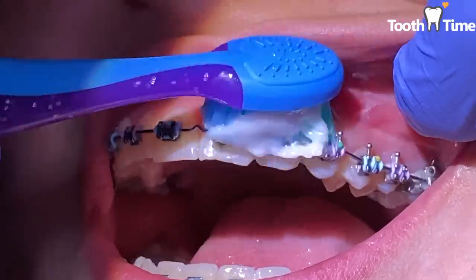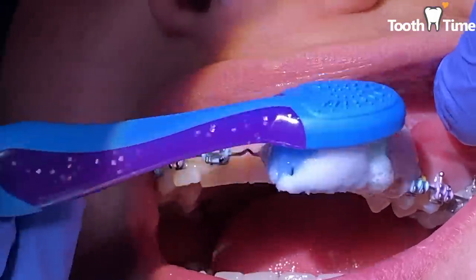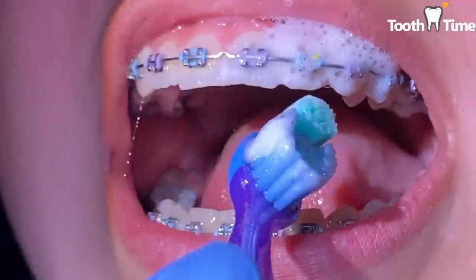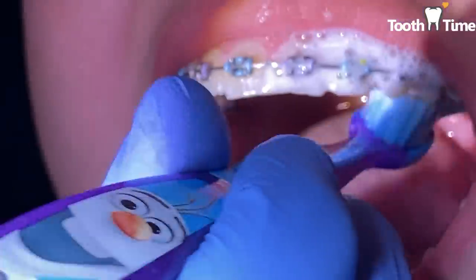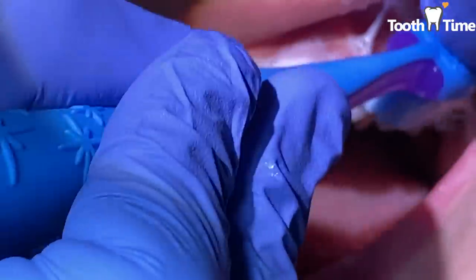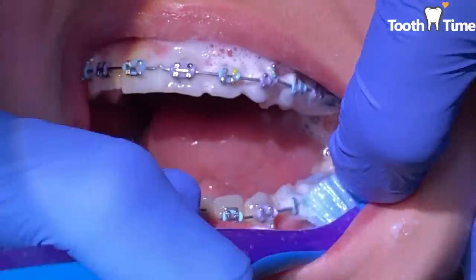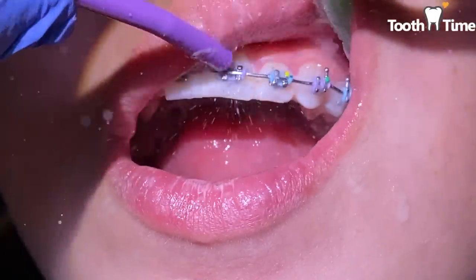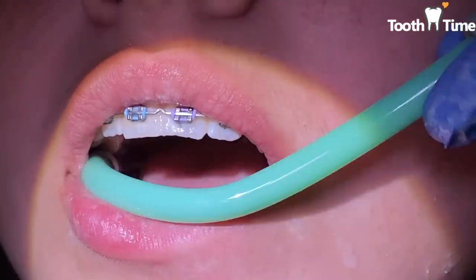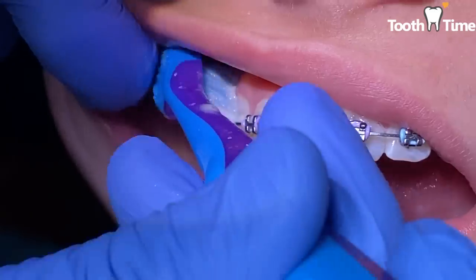For this patient I used a pediatric toothbrush. That's all I had available at the moment, but it actually worked out really well because sometimes it's hard to get around the brackets with a large toothbrush. If you can get a pediatric toothbrush and it works better for you — especially in the back areas — go ahead and do that. I'm showing her a way of brushing her teeth while she has her braces on.